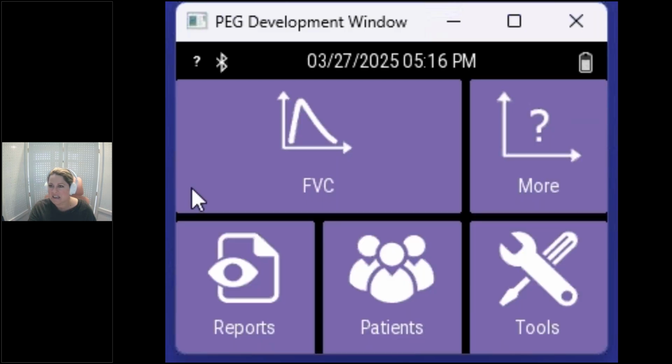All right, I'm going to stop sharing my screen here for just a second and talk a little bit about what you need for the test. So we went through a little bit of this earlier. You will obviously need your EasyOne Air spirometer. Even with the exhalation only maneuvers, we do recommend patient nose clips just to ensure that we're getting all of the volume through the spirometer. We'll need our flow tube mouthpiece. And then if your facility requires it, the EasyOne filter FT that fits directly onto the end of the mouthpiece.